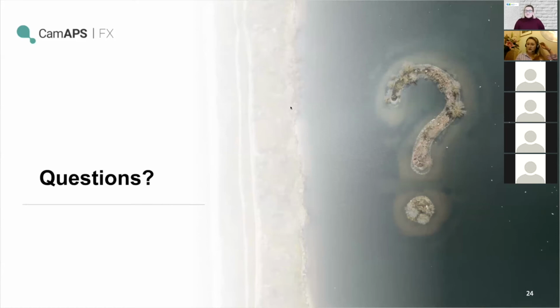Great. Next question is about glucose data getting onto Clarity. Not currently. At the moment, all the glucose data is sent to the DiaSend platform, and you can view the data.